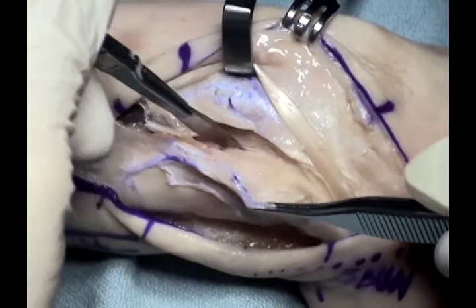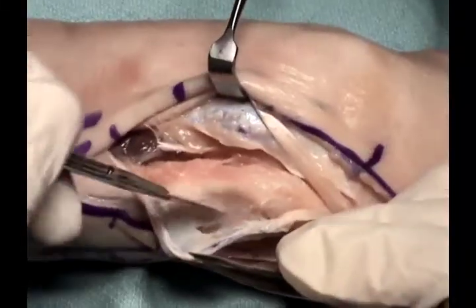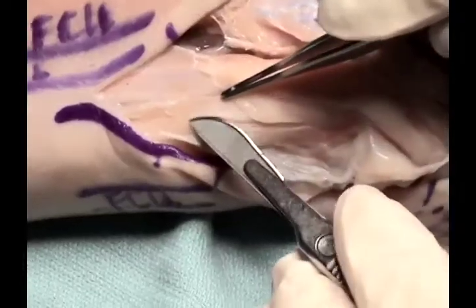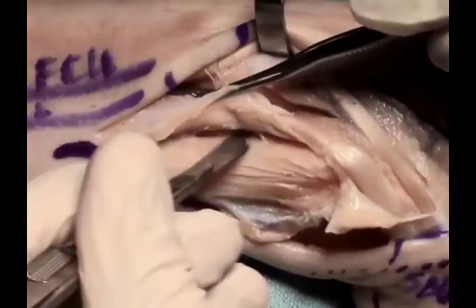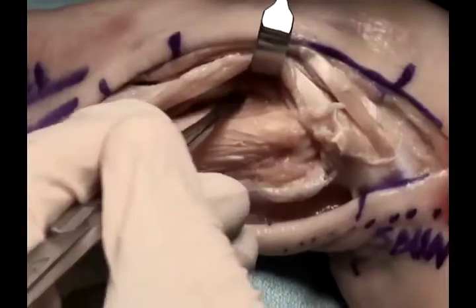In this case, the extensor digiti minimi is retracted radially and the periosteum is then elevated to retract the ECU ulnarly. The second option is to reflect the ECU and retract it radially by elevating the periosteum along its ulnar border.